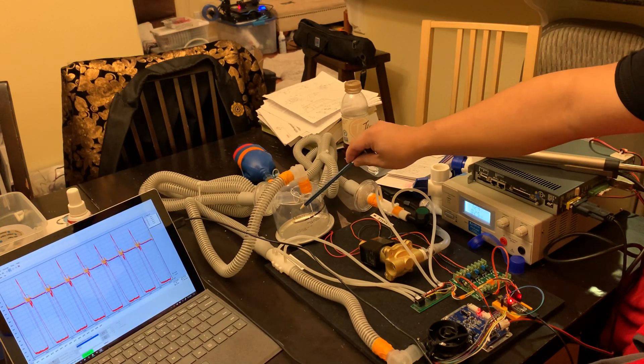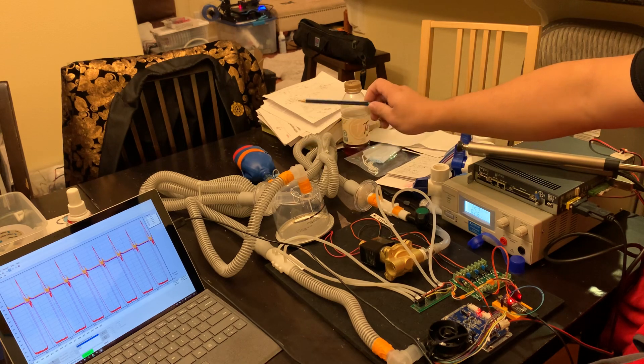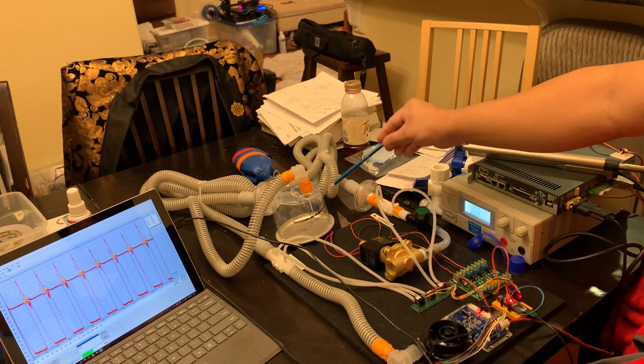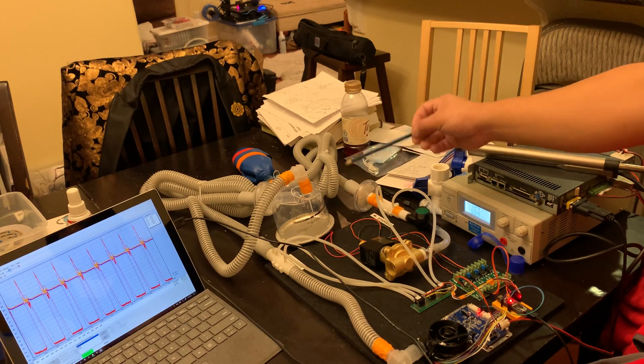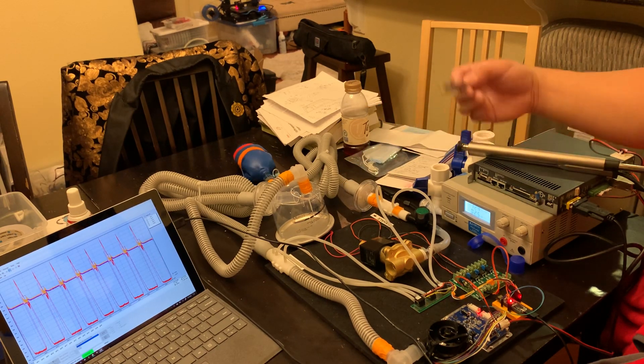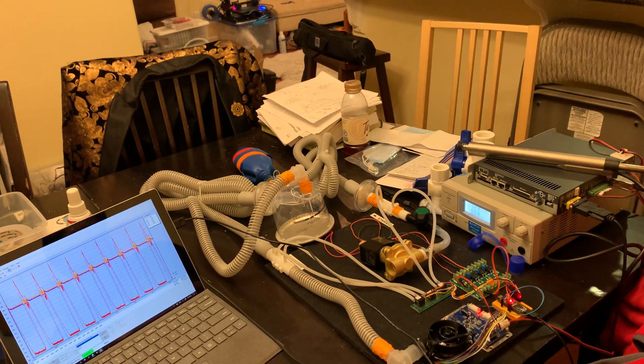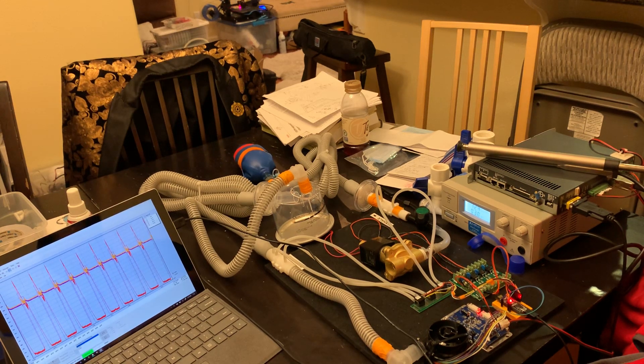We've received our heated humidification chamber, which heats and adds moisture to the air that's being delivered to the patient. This is really important because patients will typically spend weeks on the ventilator, especially if they're intubated. They don't have the sinus and the trachea to moisten and warm the air that they're receiving.